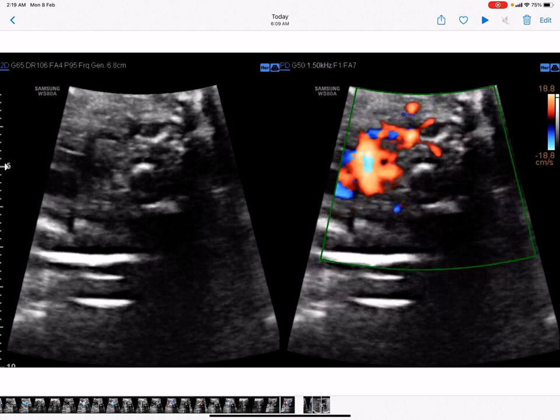And once you see a normal right subclavian artery, it automatically rules out aberrant right subclavian artery. If you use this simple technique of seeing the apex of the heart and then looking at the opposite shoulder, which is diagonally opposite to the apex of the heart, and then trying to look for an artery coming just superior to the 3 vessel view, and taking an S-shaped curve anterior to the trachea, going into the right shoulder and right arm, then that is a normal right subclavian artery.